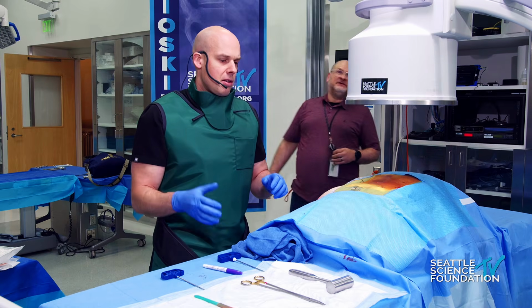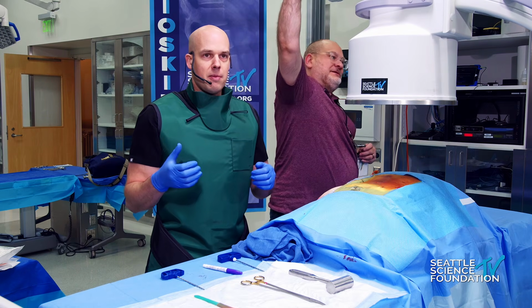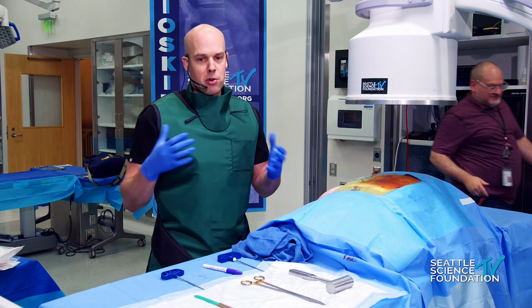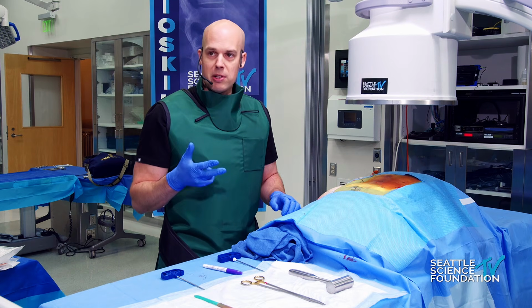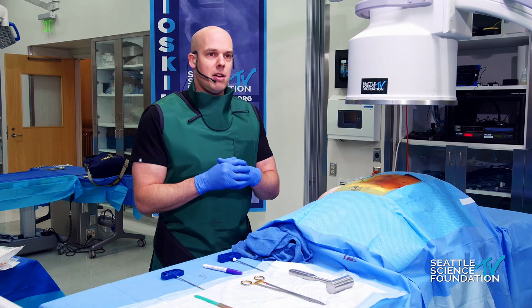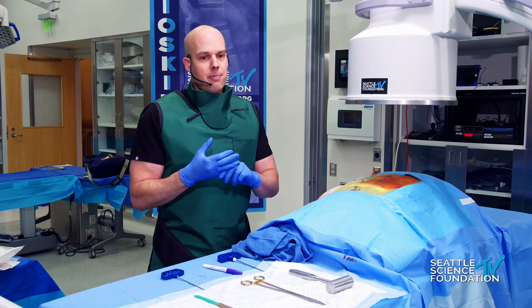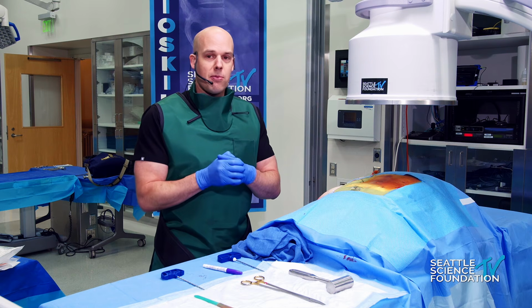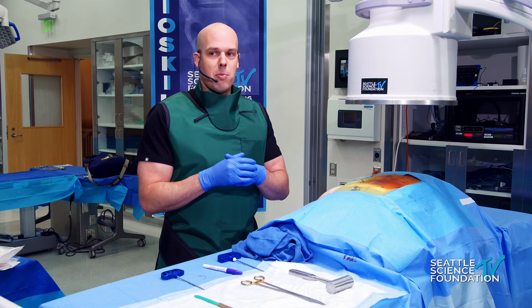Really, to optimize the success of the technique, you want to inject more cement. So there are 3 numbers really that are important to remember to be able to optimize the outcome for patients, and that will be able to deliver the maximum pain relief and structural outcome for our patients.